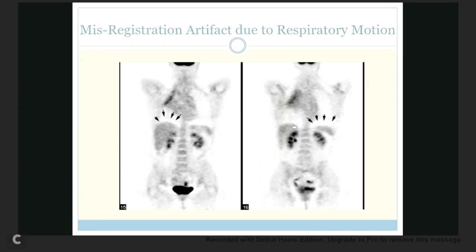This is the compressed image. If you're breathing in, your diaphragm is pushed down. Is that correct? Yes. So which one's the one that is inhalation? This one or this one? The first one, left side. I was pointing at this one.